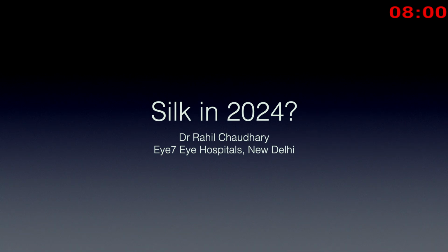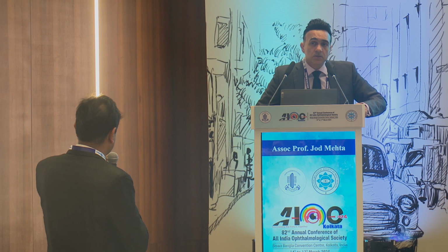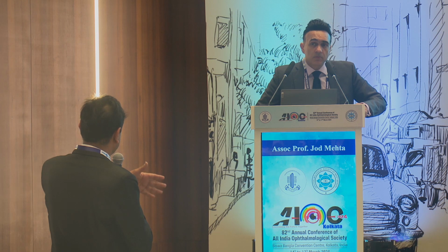So in fact, I have a series of 3 patients that we did 7 years back. You're right. One patient had a severe haze, so we had to lift and remove the inlay. The second patient had a cataract. So we just did away with the cataract, but there was just cellular infiltration all around the inlay. But she's doing well. She's one of my OR sisters.